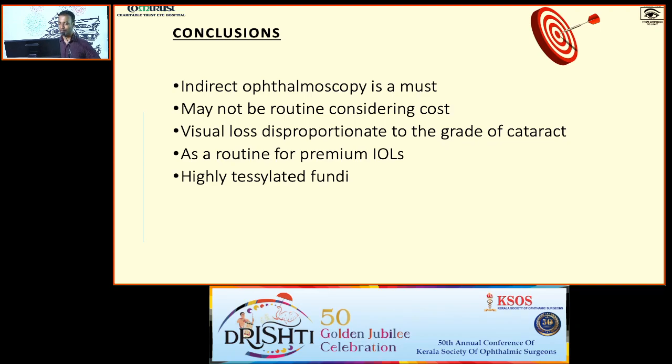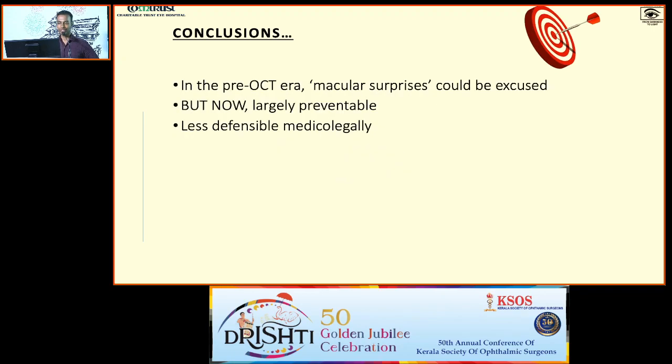OCT may not be considered routinely considering the cost, but for visual loss disproportionate to the grade of cataract, surely you have to do an OCT, and as a routine for all premium IOLs, also maybe you should consider an OCT. And for highly tessellated fundi where you cannot really make out foveal pathology, there also you should consider OCT.